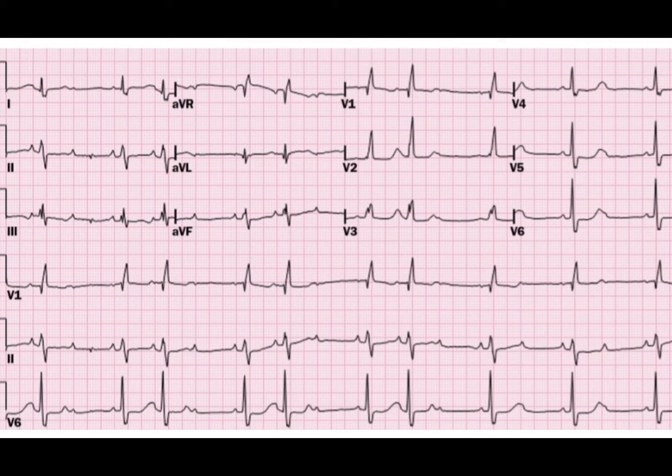Since the P wave is upright in lead 1 and lead 2, we can know for sure that it is coming from the sinus node. However, the R-to-R interval is not constant, meaning the P wave is not passing properly to the ventricles through the AV node. So it is safe to assume that there is some problem with AV nodal conduction.